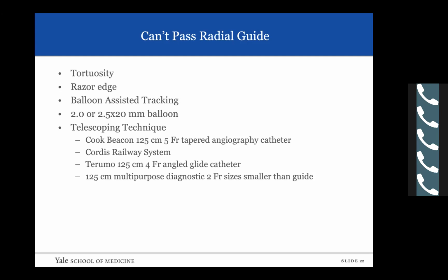Or what I've become more in favor of is the telescoping technique. We have the Terumo angled glide. It's 125 centimeters you put through, and it fills that gap in the guide with some lubricious catheter, and frequently you're able to track through. I've had one instance where that did not work and balloon-assisted tracking did.